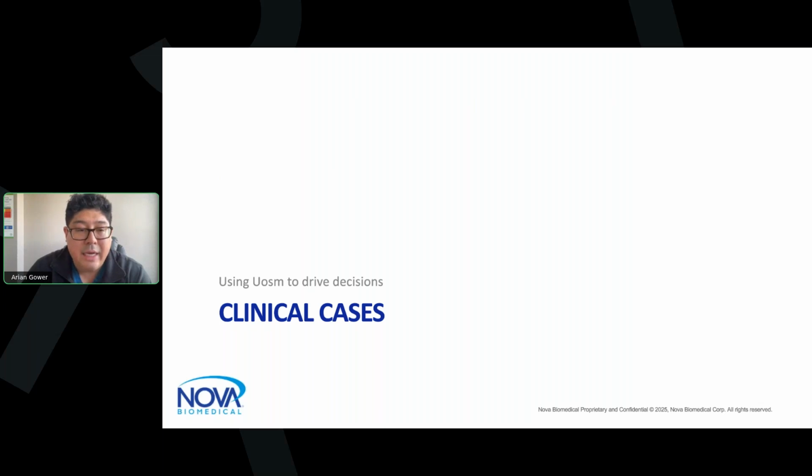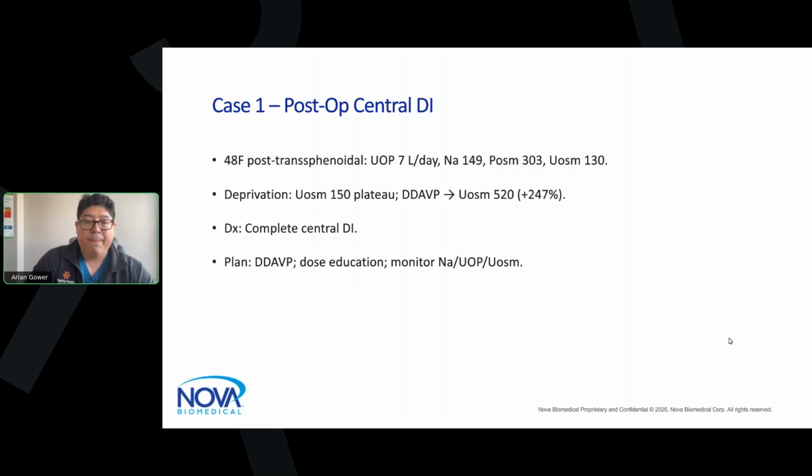So we're going to talk about some clinical cases and see if we all understood the utility of urine osmolarity testing to help guide our diagnosis. Next slide.